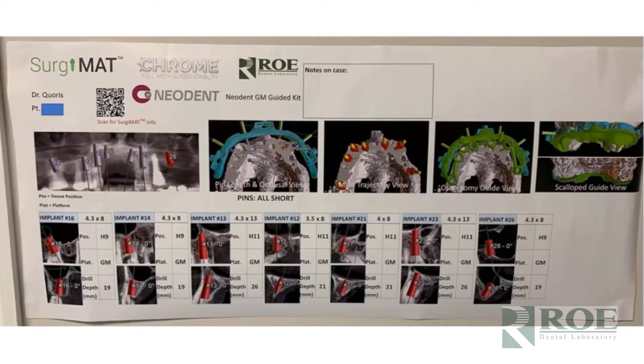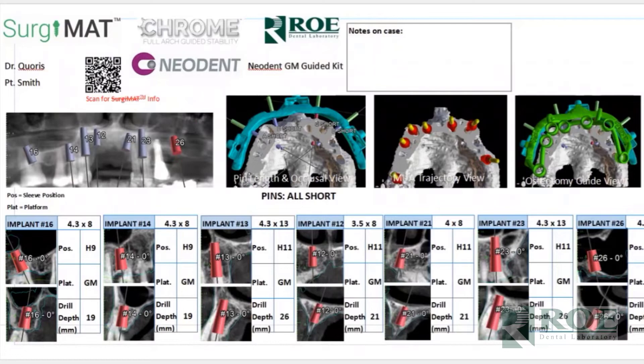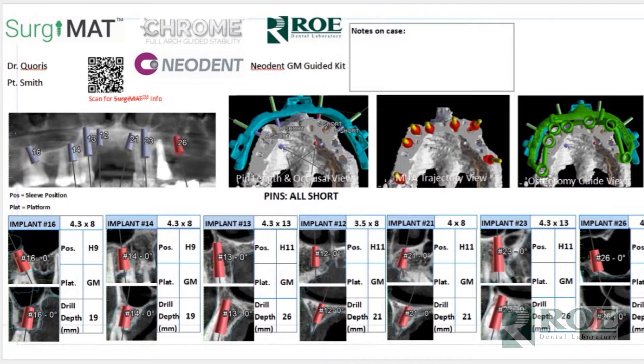With every surgery we make what's called a surgery mat. This is a Neodent case surgery mat — there's a QR code so you can watch a video about it. It has cross sections of the fixation base, how the MUAs will be rotated in the mouth, the trajectory of the implants, an image of the osteotomy guide so you can visually see what they should look like in their respective positions, images of the scallop guide, and cross sections of the implants in a 360 view.